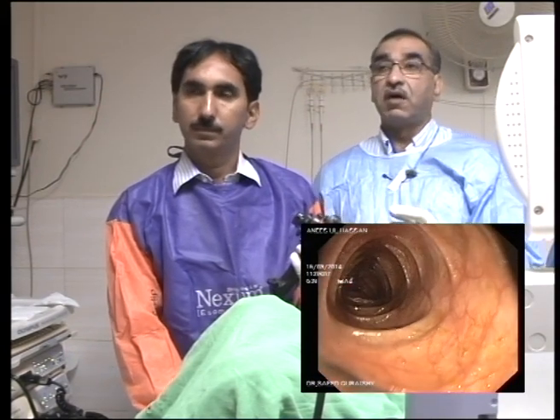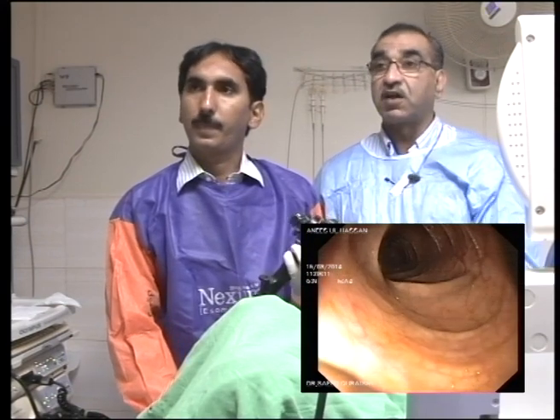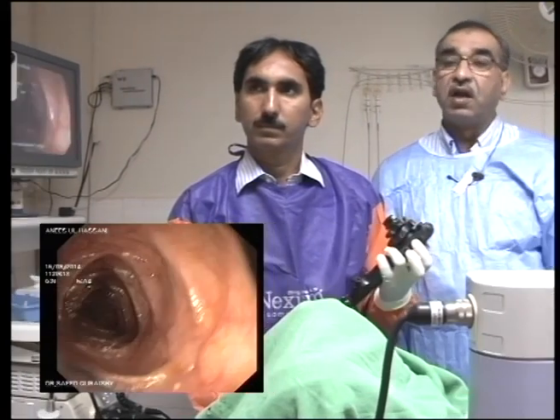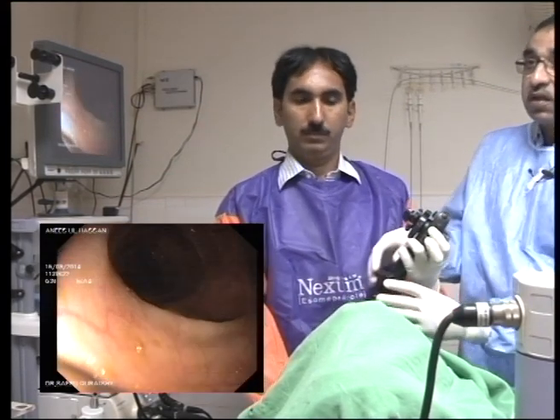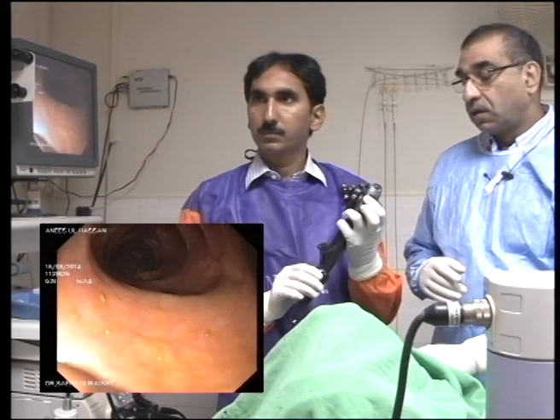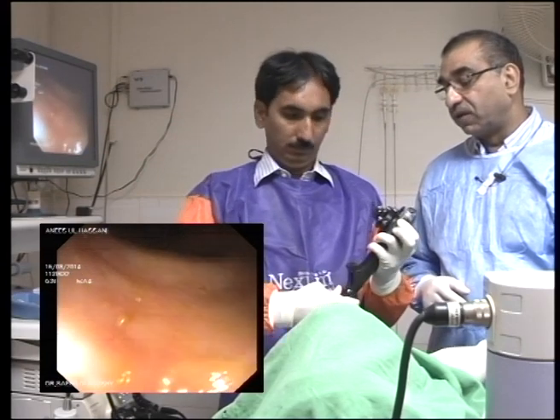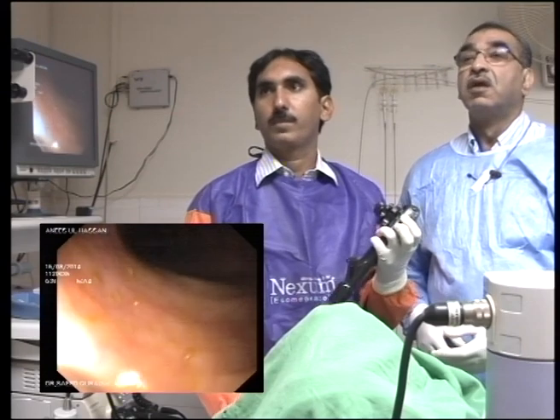Now advance. Deflate a little. Just suck a bit. Up, advance your scope. Gentle. You can go now. At this stage, if you want to make life easier, you can stiffen the scope up. Turn it fully, full. Yeah, it's either 0 or 3. There's no in between stiffener. Yeah, that's it. That will just give you a bit more support. Okay, now advance.